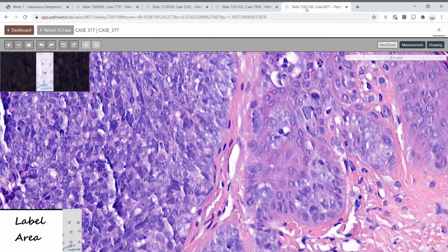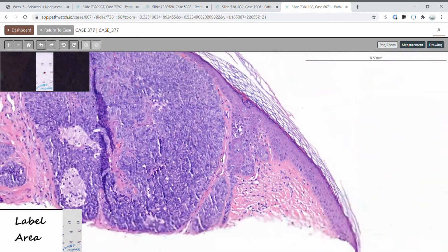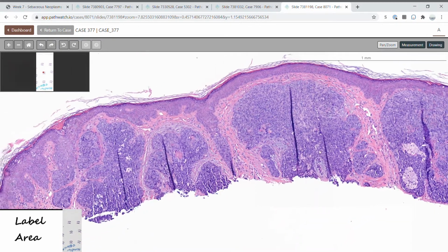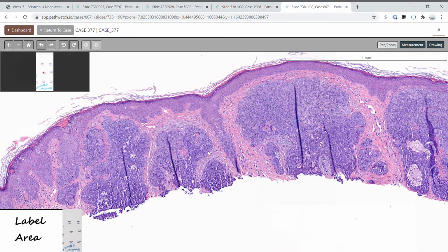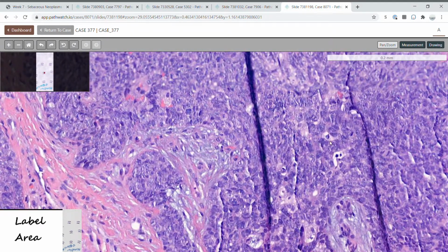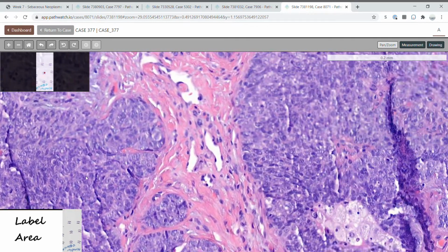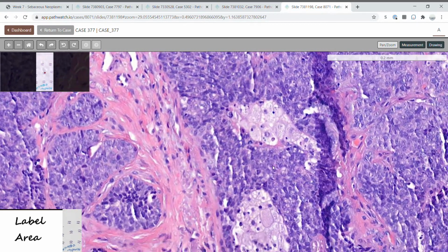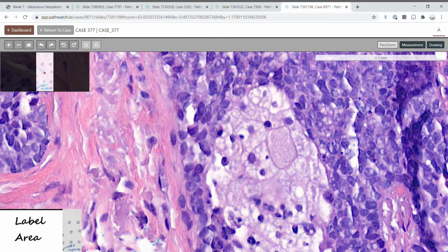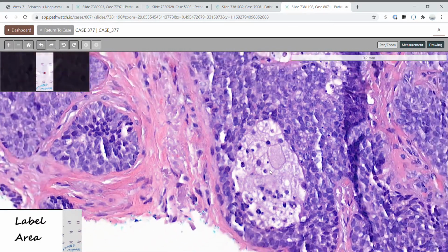The malignant counterpart of a sebaceous neoplasm is here. This is sebaceous carcinoma. Sebaceous carcinoma is most common in the eyelid, originating from the meibomian gland. Sebaceous carcinoma can involve the dermis, as a proliferation of predominantly immature cells. These cells show increased proliferative activity with apoptotic figures and increased nuclear to cytoplasmic ratio as well as nuclear atypia. Interspersed with the cells, you can see differentiation into sebaceous cells with foamy cytoplasm that commonly indents the central nucleus.